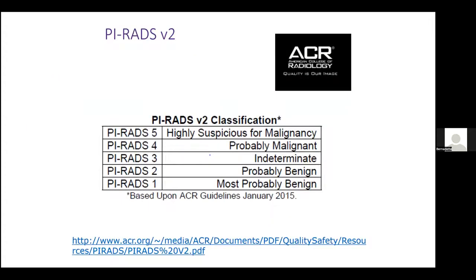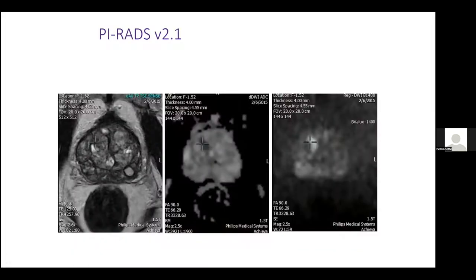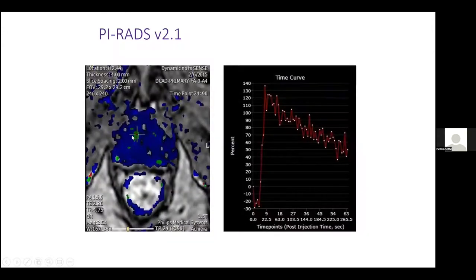And then this was further supported by the American College of Radiology PI-RADS classification, which is the Prostate Imaging Reporting and Data System, where we talk about what's worth sticking a needle into and what's not. And so everything that gets an MRI should have a PI-RADS category assigned to it. And basically, if it's dark on this sequence, dark on this sequence, bright on this sequence, and contrast enhances, and we see a rapid pharmacokinetic response to gadolinium-based contrast, probably you should stick a needle in it.